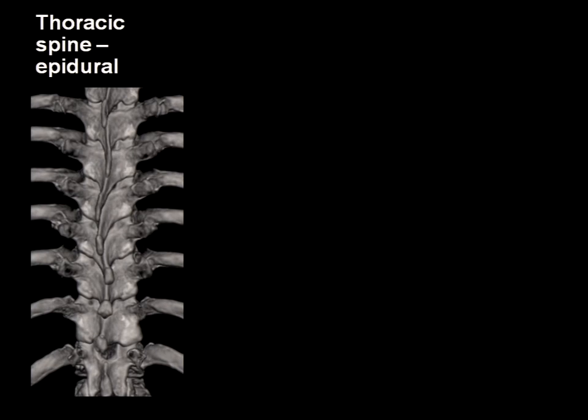When we are going to the thoracic spine, it's a little bit more complicated, a little bit more different. This is a 3D reconstruction of a thoracic spine of a patient. You see what Bernhard Morigel told us before, that the spinous processes, usually they are not straight like in the models, they are rotated. And what you can see here, interlaminar, can you see a hole here? I can't, I see only bone.